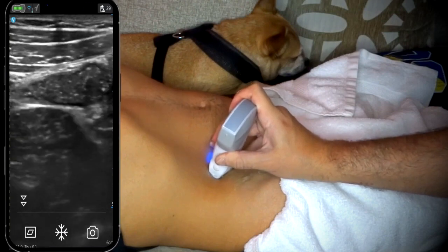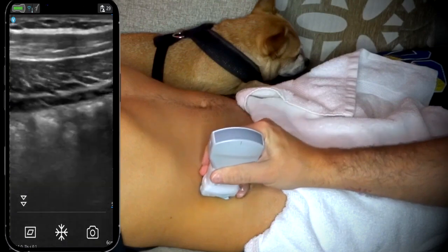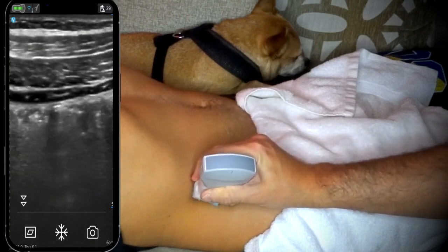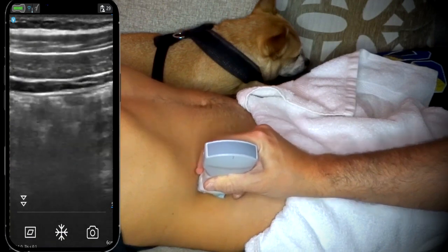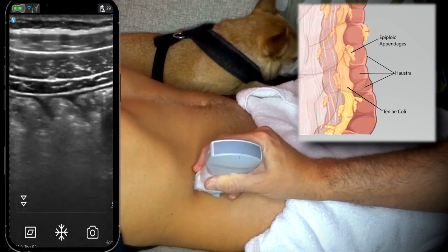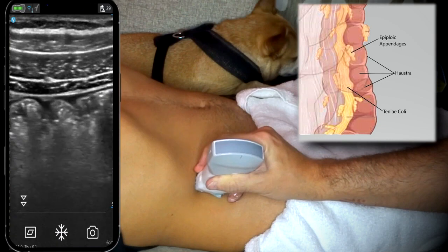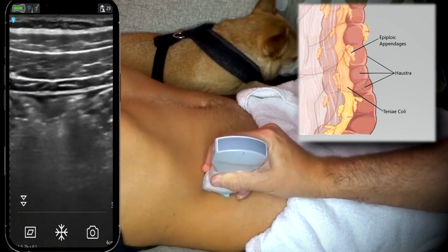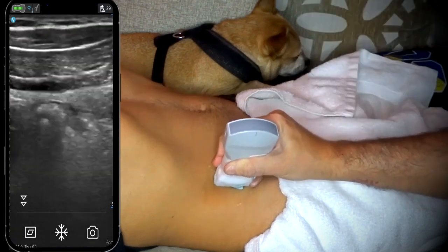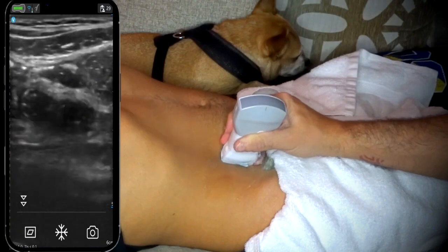So that's regular bowel there. You can see it's thin-walled. And then let's see if we can see. Oftentimes the ascending colon is full of air. You can't really make out the ascending colon. But if there's bowel wall thickening, you can see it. And if there's not that much air, you can see it. But that's the haustra right there that I was talking about. So I know this is ascending colon. Right there, you see there's like a little pouch there. Another little pouch there. Another little pouch there. So you have the haustra of the colon. And you'll see that in the ascending, transverse, and descending colon. And in the small bowel, you won't see that.